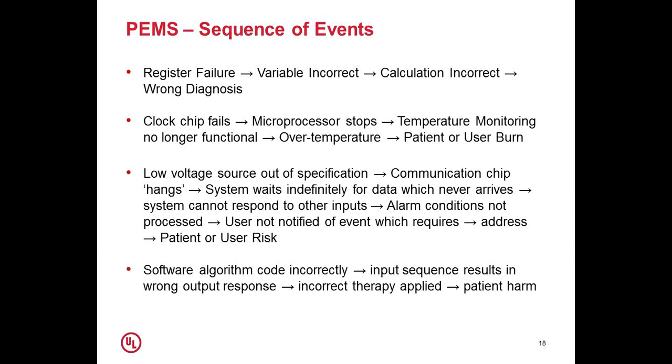Another situation of a sequence of events: a low voltage source out of specification results in a communication chip hanging. This is very common, which we have seen very frequently, and we also see it in our mobile phones today. Similarly, when it happens on a medical device, the risk is higher. A system waits indefinitely for data which never arrives, and the system cannot respond to other inputs. If this microprocessor is used for an alarm, the alarm condition is not processed, and the user is not notified of an event which requires attention by a patient or user.